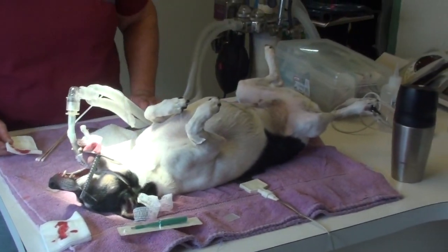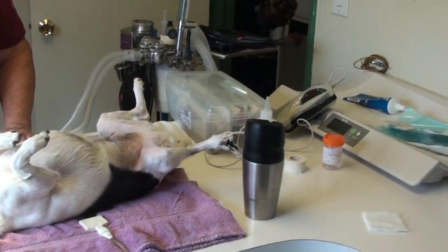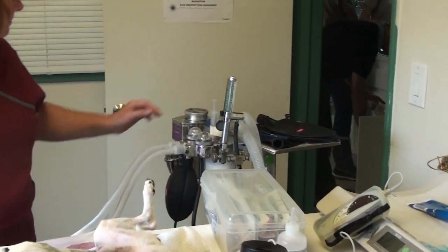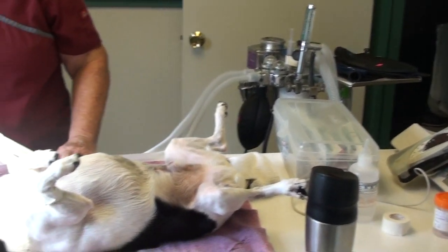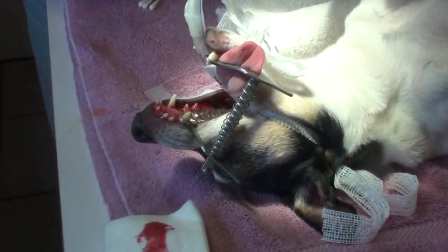So when we biopsy, we have to use anesthetic because most dogs won't let us take little pieces of their tissues without it.